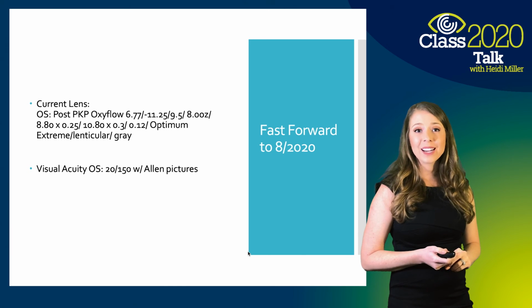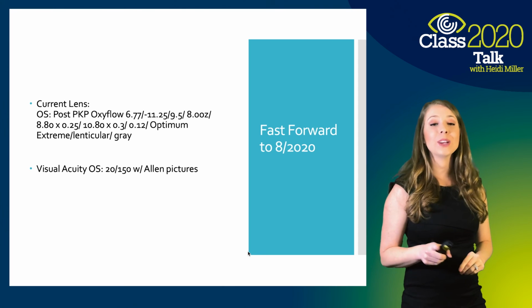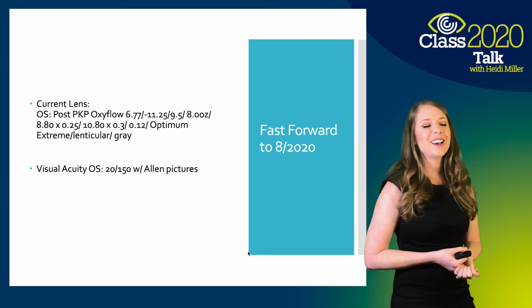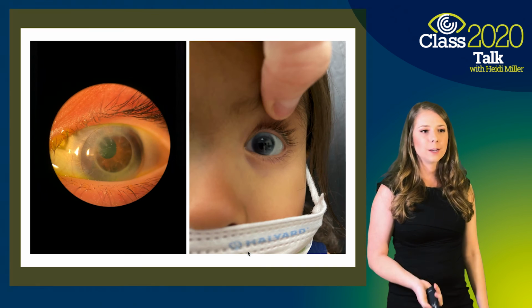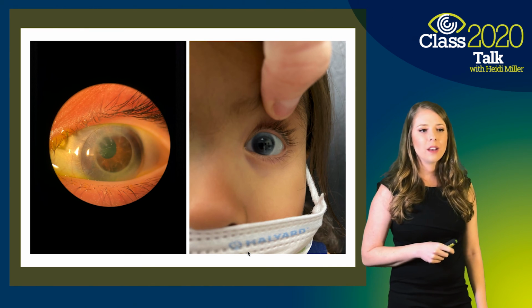And this time she was very excited because I told her, "You're going to be famous, okay? We're going to take some pictures so that you can be famous." And she's like, "Can I look at my pictures?" So I thought it's great to follow these children from when they're a baby to now she's 4 years old. So this is that photo, and you can see that corneal GP on there.